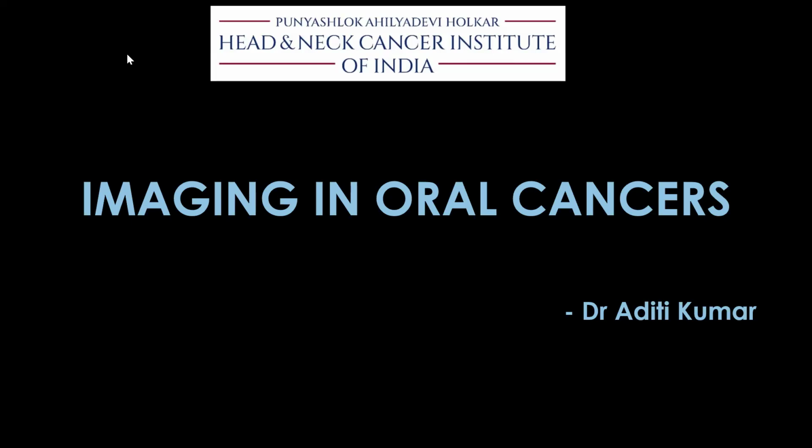Good morning, everyone. I'll be speaking on imaging in oral cancers. So briefly, first I'll be dealing with the relevant imaging anatomy, because that helps in further delineating diseases better. And from there on, we'll look at some cases which will give us a better comprehensive understanding of what we have discussed.